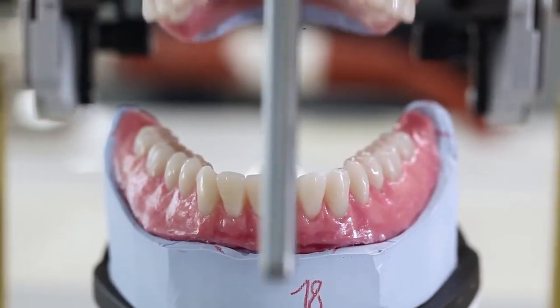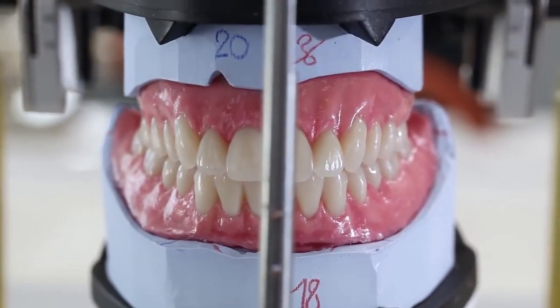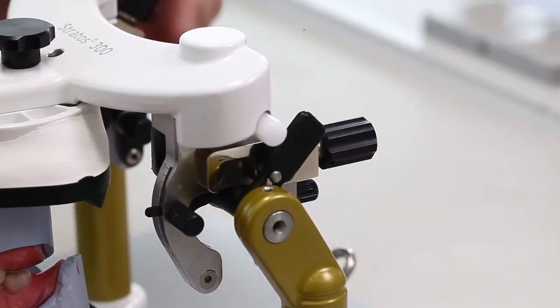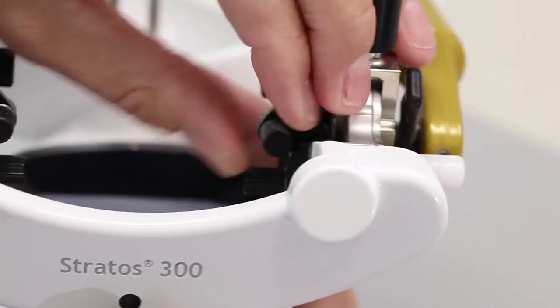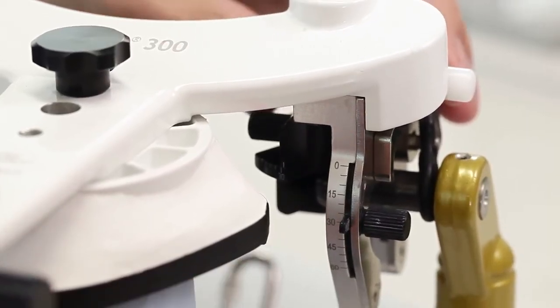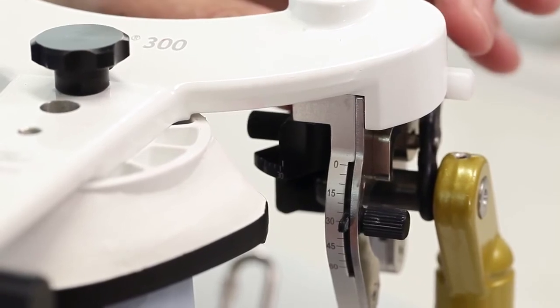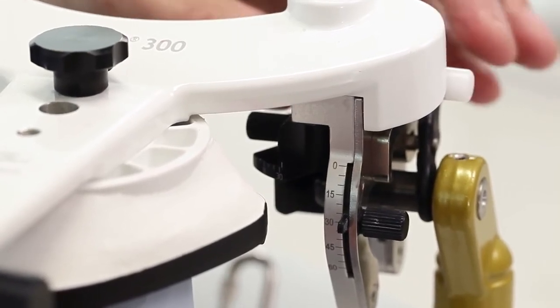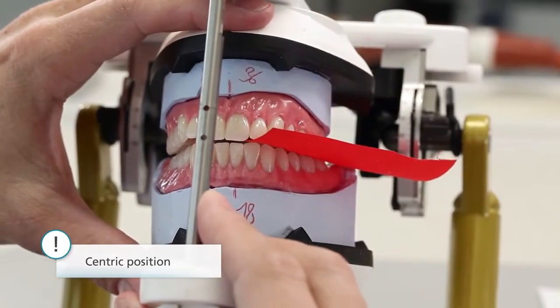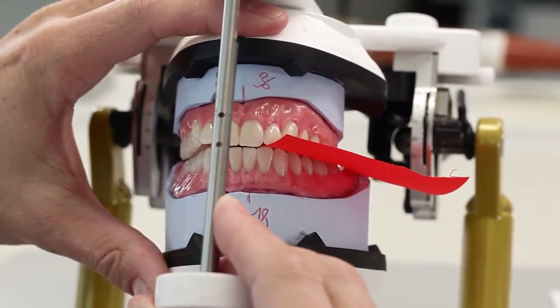As soon as the dentures have been completed in wax, check their occlusal function. Open the centric lock, the Bennett angle and the immediate side shift movement in the articulator. The protrusion angle should remain secured at 30 degrees according to average values. Check the occlusal functions starting from the centric position.